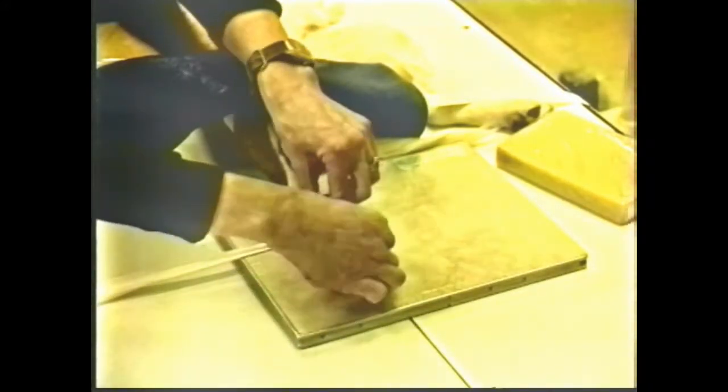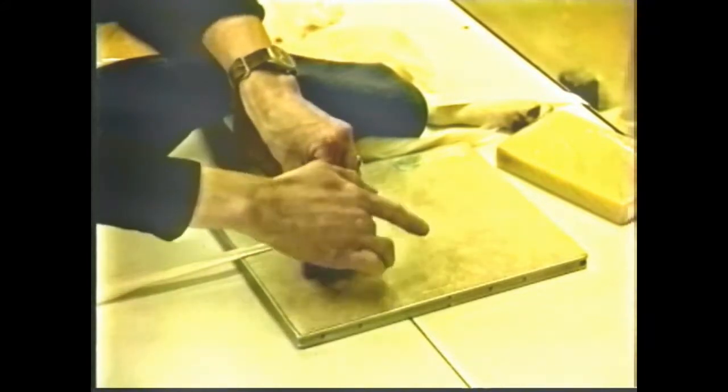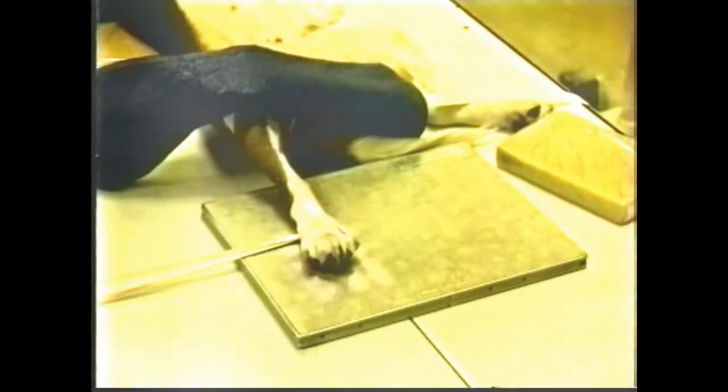The dorsal plantar view is done similar to the hock. Sandbags or lead gloves can be used to weight down the leg and hold in position. You will notice that we used cotton between the toes so that the toes would be spread slightly for better viewing of the digits.